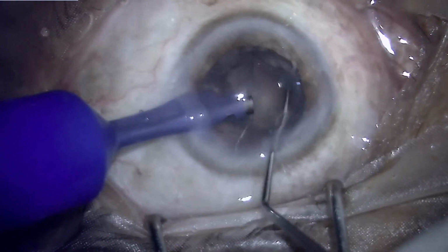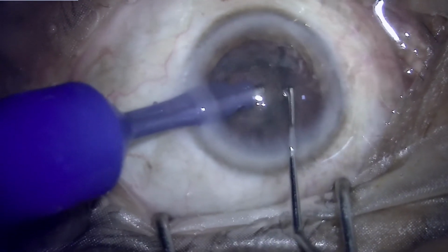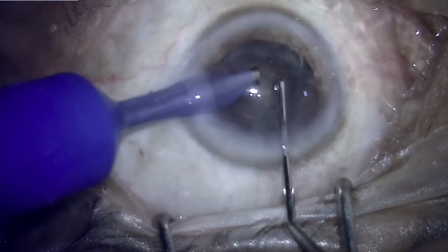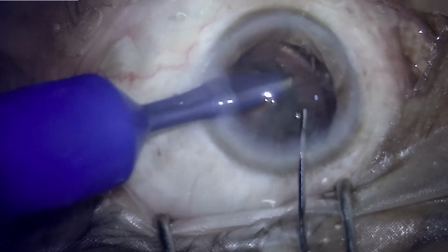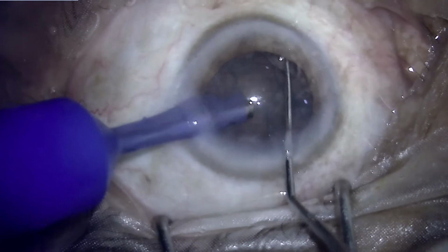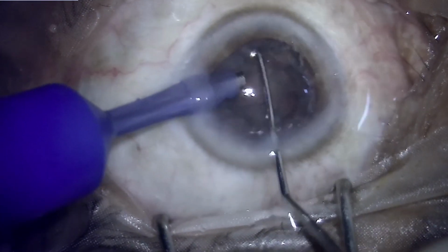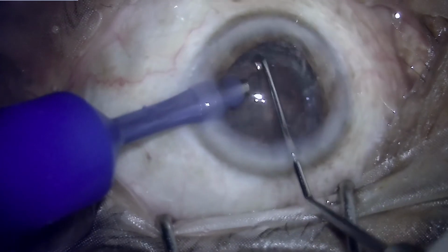So the concerns are mainly that the soft cataract doesn't allow any holding power to the tip, so the chopping maneuver fails, and the capability to go ahead up to the deepest part of the nuclei is limited, because one is always concerned about the phaco tip going through and through and hitting the posterior capsule, and in that scenario the posterior capsule is bound to get torn, and with a large portion of the nucleus in the bag and the posterior capsule getting damaged means only one thing, that the nucleus is going to sink into the vitreous cavity and cause a further complication.